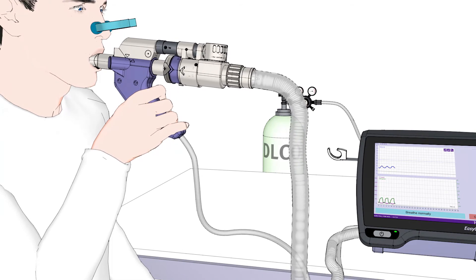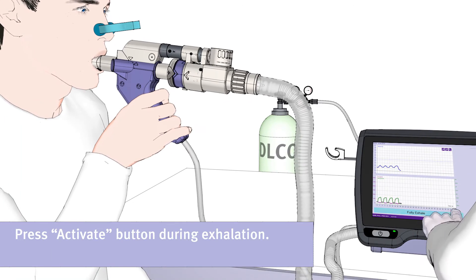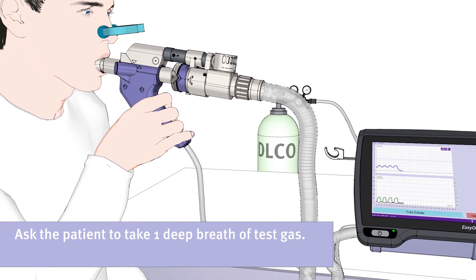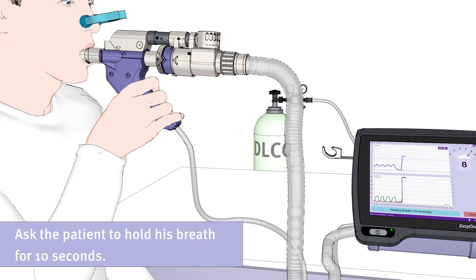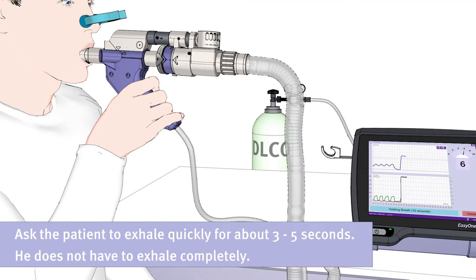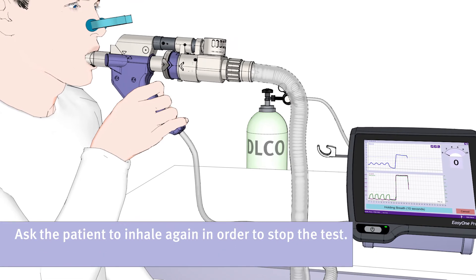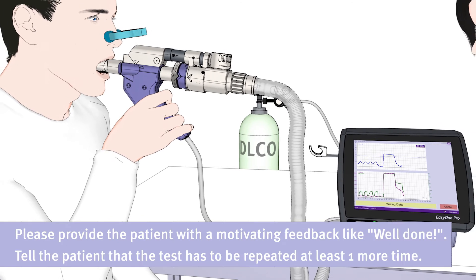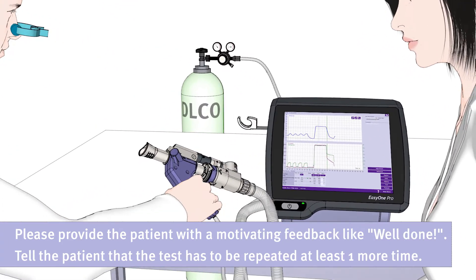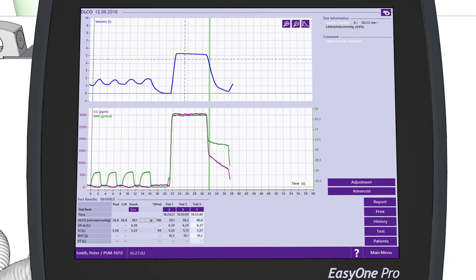Then, ask the patient to exhale completely. During exhalation, please press the button Activate when the display shows Deep Breath In. Ask the patient to take one deep breath of test gas and to inhale deeply and quickly as much as he can. Ask the patient to hold his breath for ten seconds, then to exhale quickly for about three to five seconds — he does not have to exhale completely. Ask the patient to inhale again in order to stop the test. Please provide the patient with motivating feedback like well done, and tell him that the test has to be repeated at least one more time.